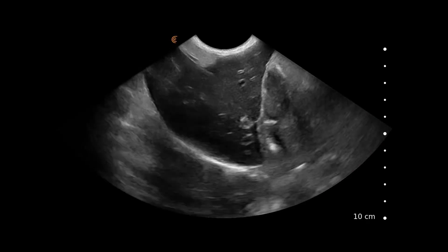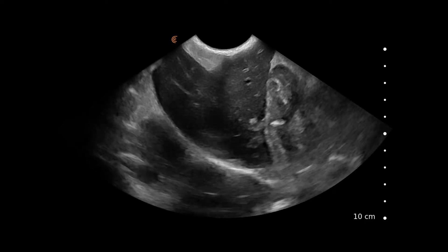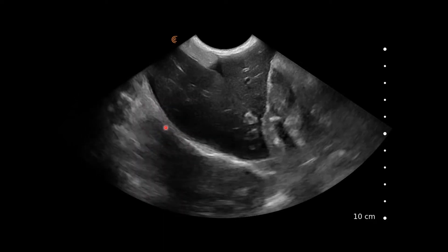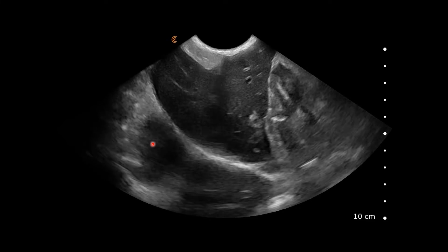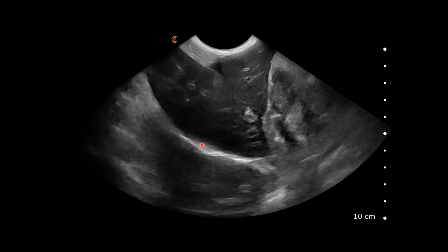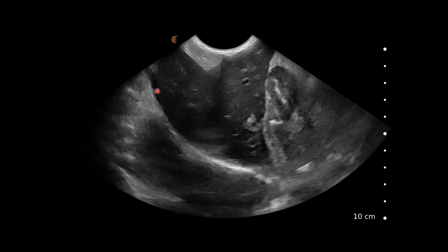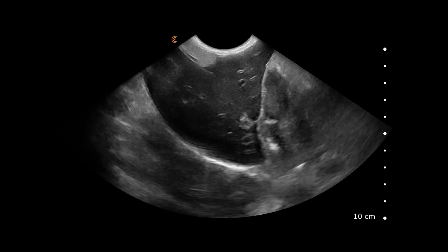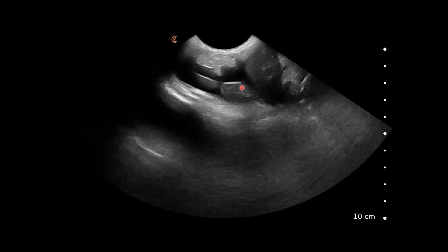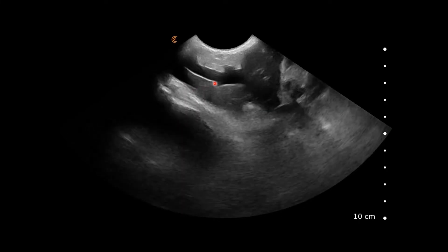Here we have a cranial abdomen view where we can see the diaphragm along here. This is the chest cavity and we can just see the heart beating in here. This hypoechoic structure here is the liver, and we can see a little pocket of free fluid there and possibly some in the cranial part of the abdomen also. Fanning through, it becomes more clear that there is free fluid surrounding the liver.